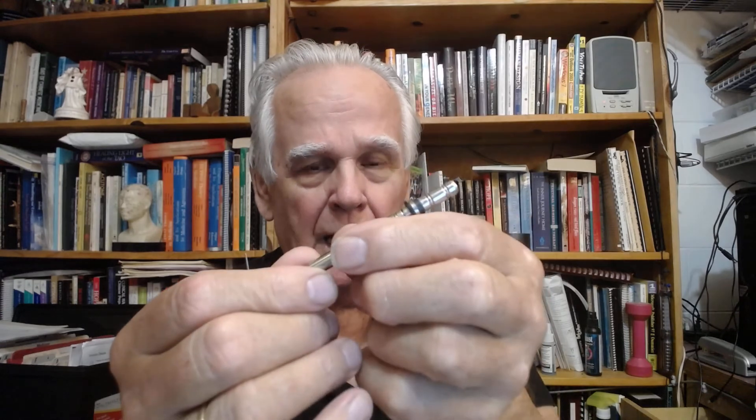Now if you want to do an angled insertion — I don't recall if that's part of Master Tong's approach — but if you do an angled insertion, then you have to tap it in, like that.